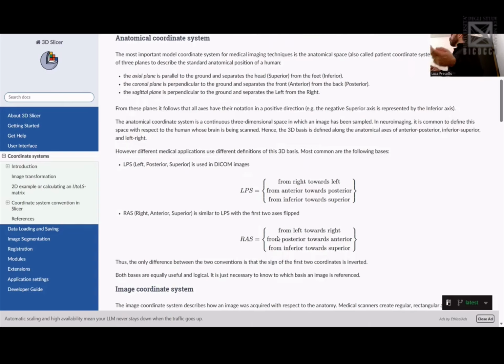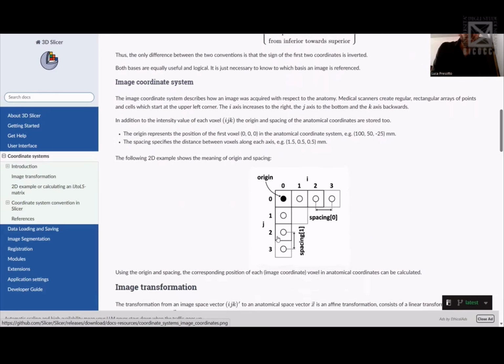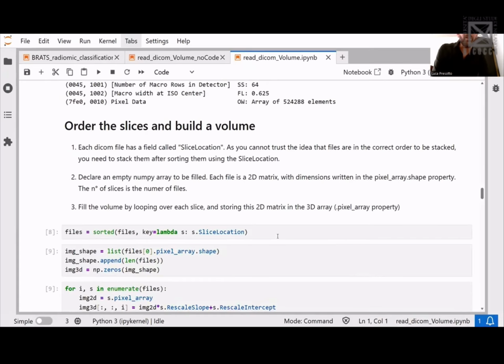When you see an abdomen, maybe it's not an issue. You know if the heart is on the left or on the right, and you should be able to pick a left arm from the right arm, even if people with the heart on the right side do exist. But if you're looking at the brain, there's no way to recognize the right from the left hemisphere. So if they don't tell you how the patient was rotated when inserted into the machine, you don't get it. So that's just a side note.